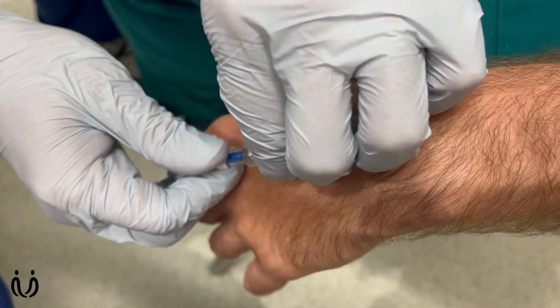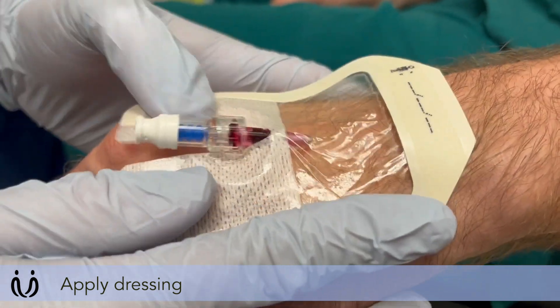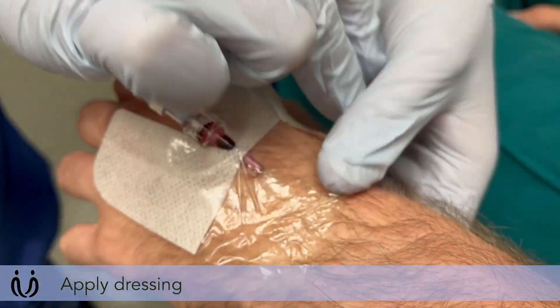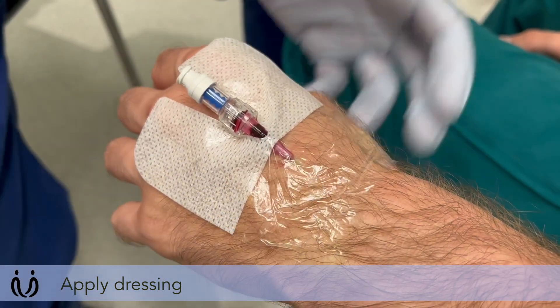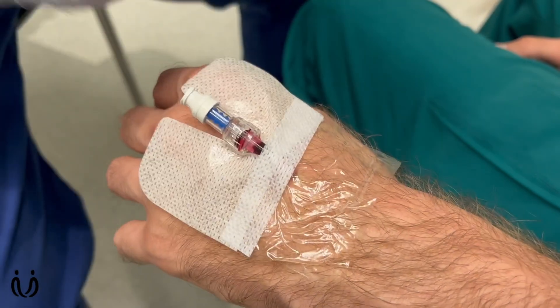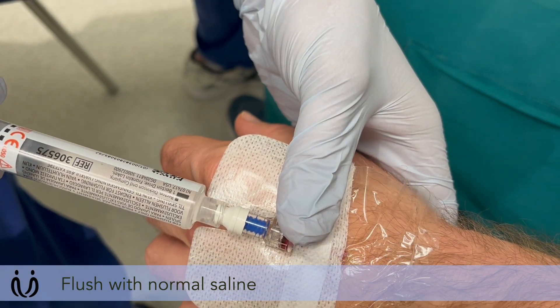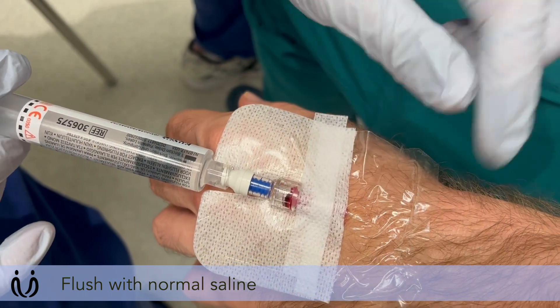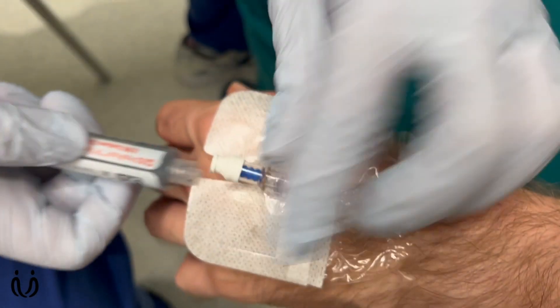Now place the bung on the end of the cannula, then place a Tegaderm over the top so it's nice and secure. In patients with some hair on the arms or forearms, you might need to use some Tegaderm or other tape to make sure it sticks down nicely. Just place a little bit of normal saline in now to make sure it's flushing well — you'll feel a bit of a cool sensation going up — and check there are no signs of subcutaneous oedema, which might suggest the drip has tissued.